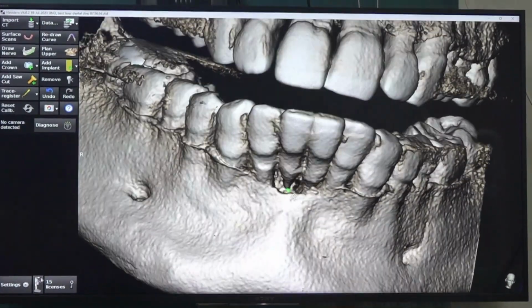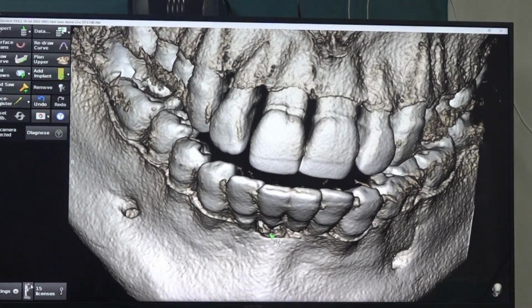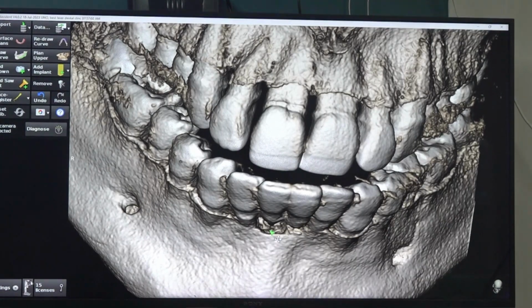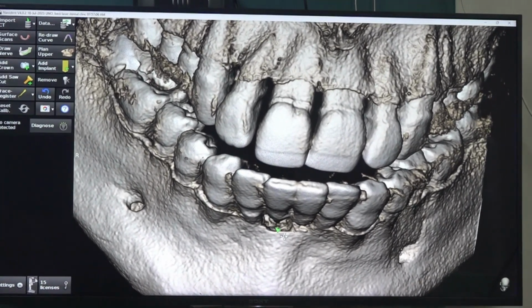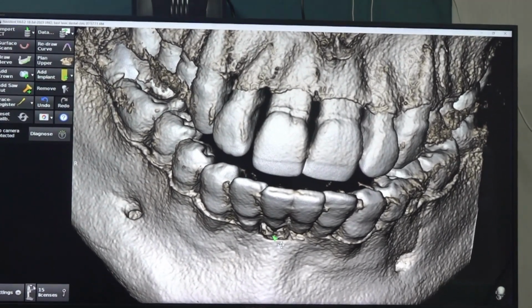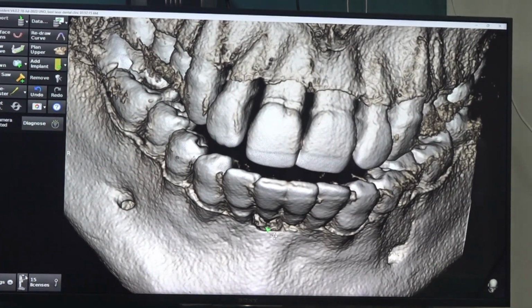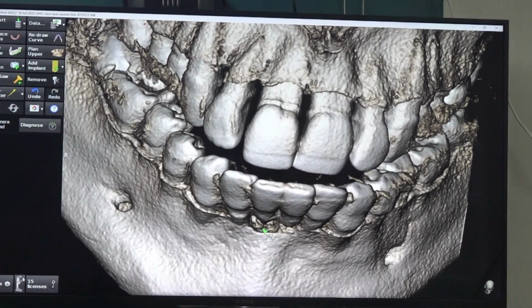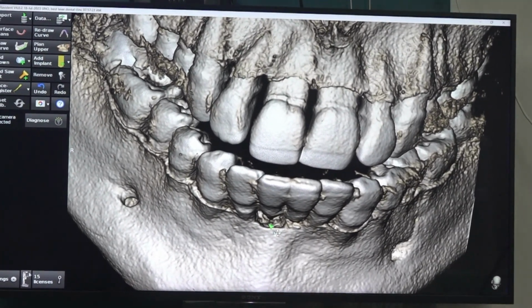Most commonly, if you are extracting 1 incisor, 1 implant. 2 incisors, 1 implant, you can give 1 tooth as cantilever. If you place 2 implants for 2 incisors, then the implants will be close to each other. The implants will be close to the natural tooth. If you are lucky, it may give no trouble, but otherwise you may get trouble. Both the implants may fail.